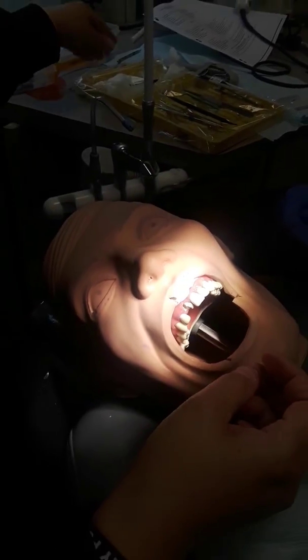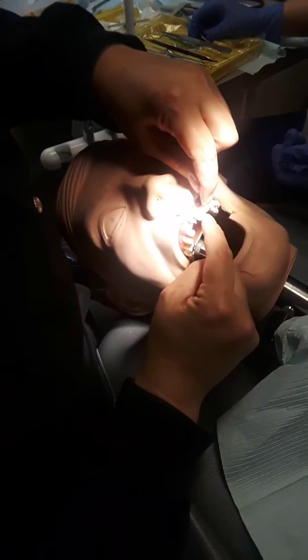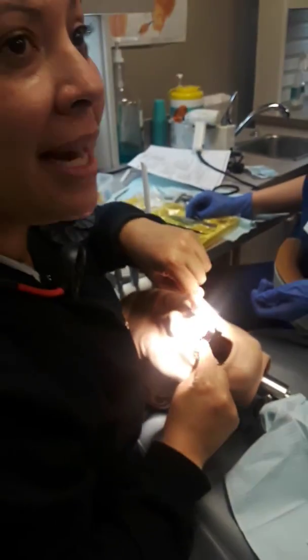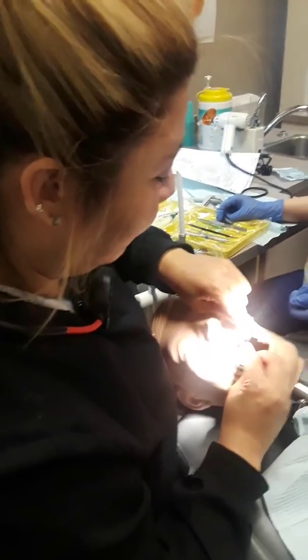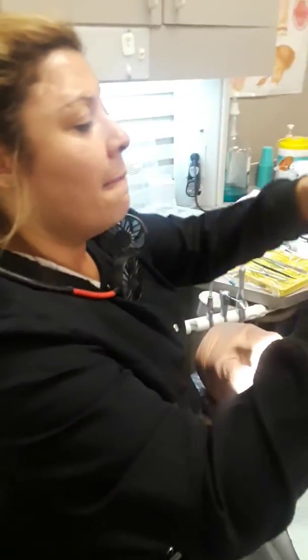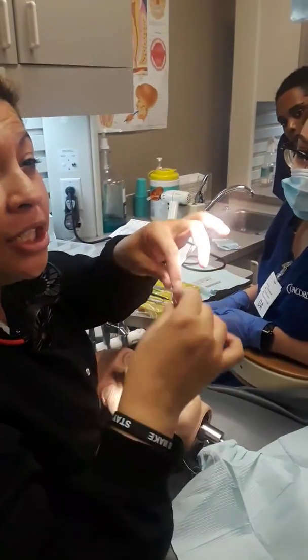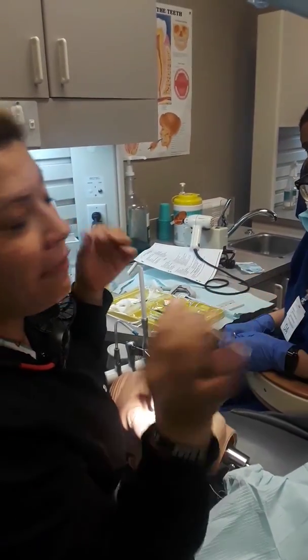Test your floss again — it should be smoother now. But I have no contact anymore! If you use a finishing strip, you can take out the contact. When I didn't use it, it was already tight — now it's loose. As an EDDA, this is hard to use because one swipe can take off your contact, so know when and when not to use it.